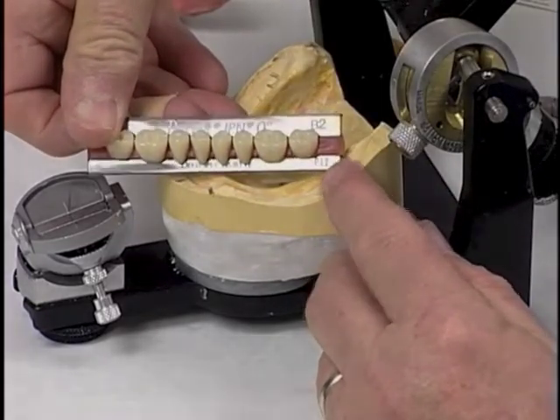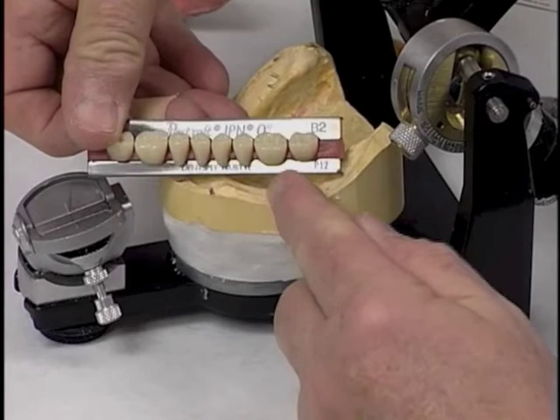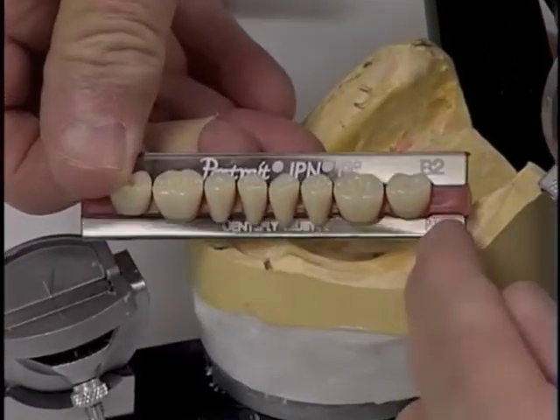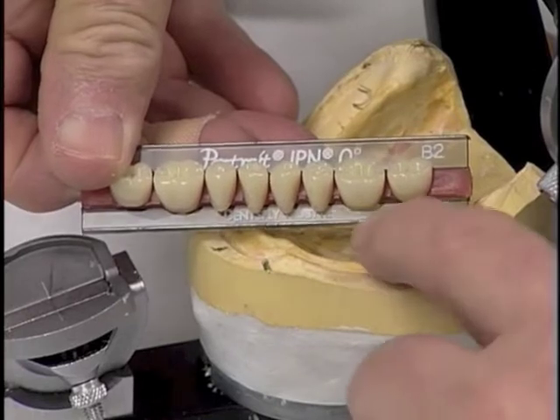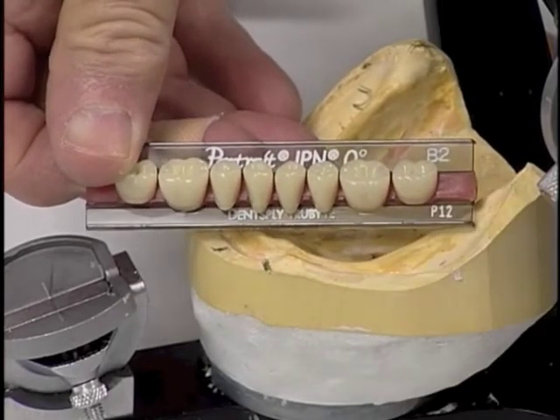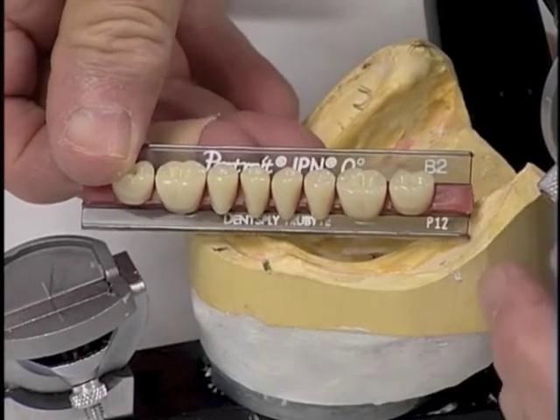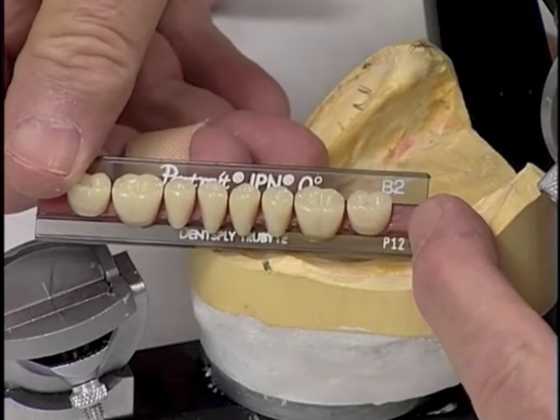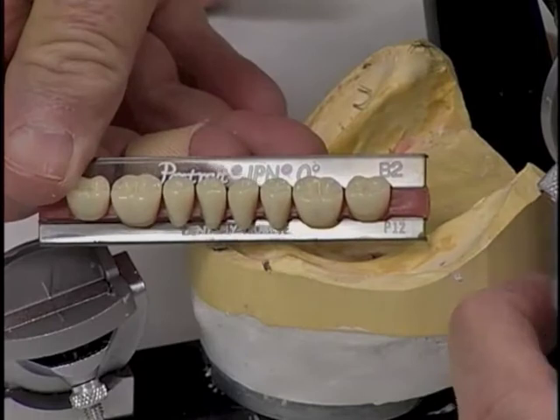As we can see, if we use the first premolars and we have the mesial on where that mark is, which would be the distal of the canine, this tooth is too far back. It's on this upward slope of the ridge, far too much. So let's see what would happen if we eliminate one premolar. We bring it up to where we're eliminating one premolar, and now that's much closer.